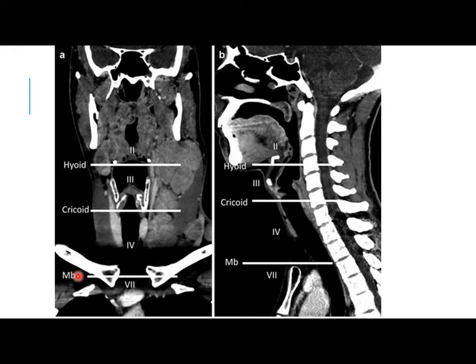Usually, if the lymph node is enlarged homogeneously, in its normal oval shape with preserved hilum, this may be a normal benign reactive lymphadenopathy. While a metastatic lymphadenopathy in the neck usually becomes rounded, loses its ovoid shape, and usually has a necrotic area if it is associated with a squamous cell carcinoma of the head and neck.